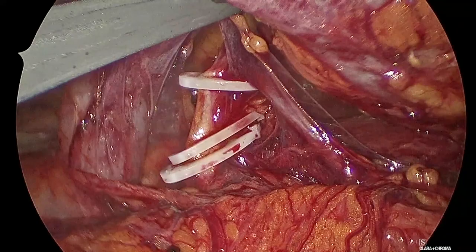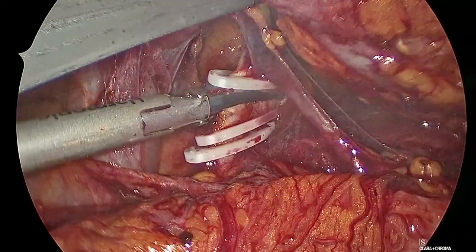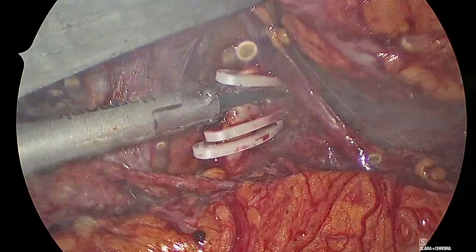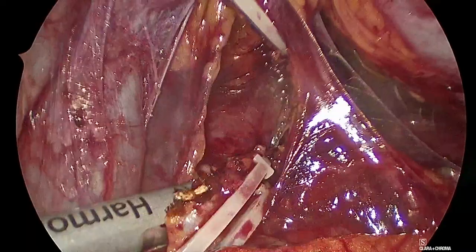My educated guess would be that we have to follow with the lymphadenectomy the blood supply of the ureter. Mm-hmm. So for the mid ureter, you would take the para-aortic. I also would include the hilar lymph nodes of the kidney. Mm-hmm. Hemolock.